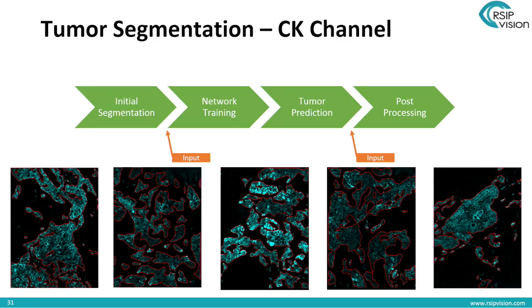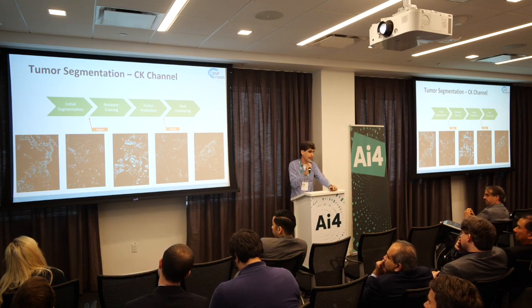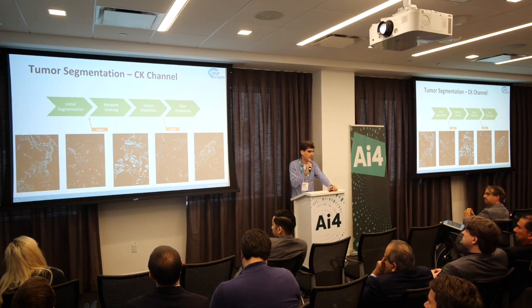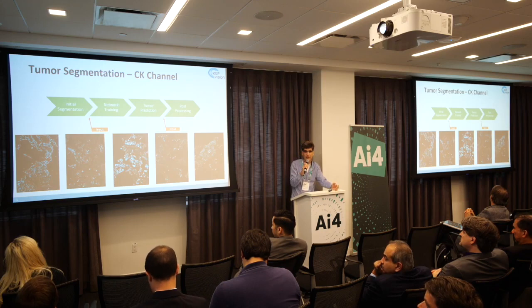Here, again, the architecture itself is actually pretty similar. It's also a segmentation task. You're just training it on a different type of ground truth. What's interesting here is how to get the data annotated and how much data you need annotated. Because if you don't have enough slides, then the network's not going to learn. It still takes a lot of annotation.